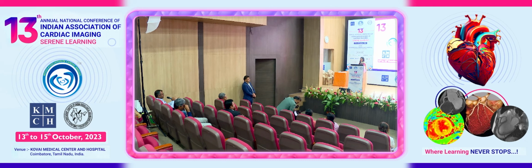In distal? In distal, okay. Because it is the distal third of the LAD. But we don't put it at all in the report as well. Only if it is immediately distal to the lesion, we say anything. Anything distal to it, we just put in the comment: may represent some ischemia.